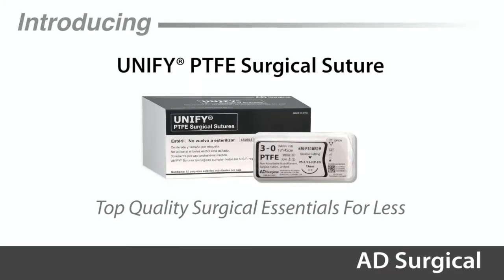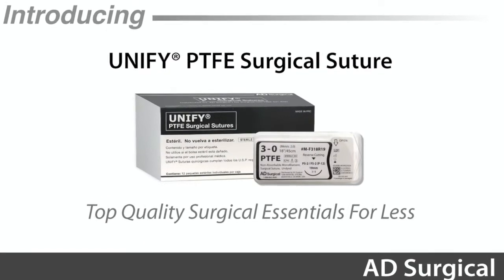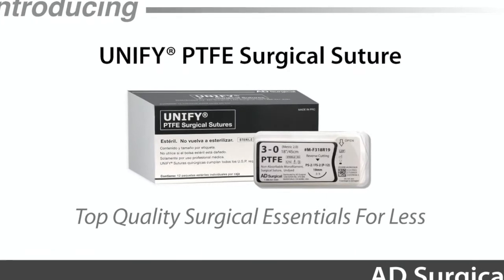Introducing UNIFY PTFE Surgical Suture — top quality surgical essentials for less.